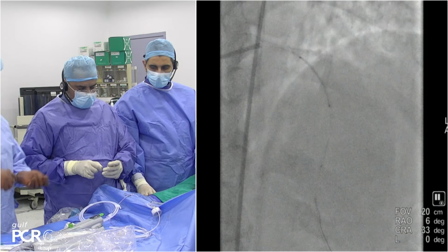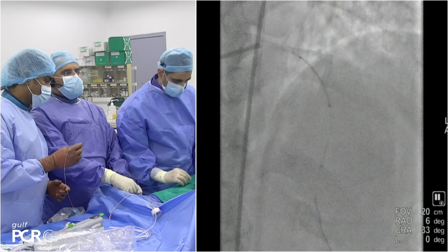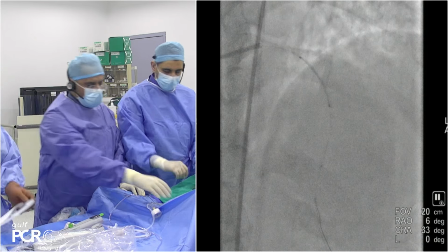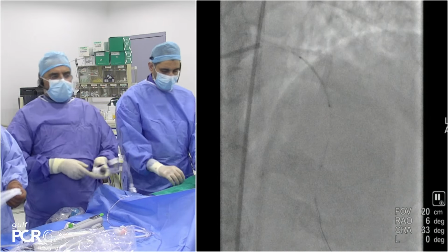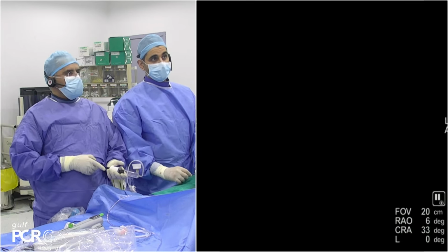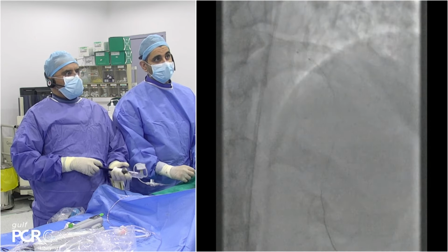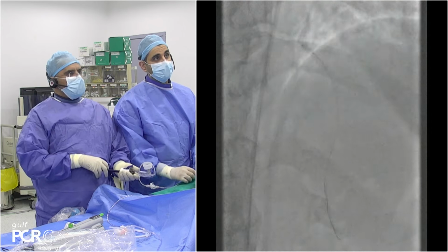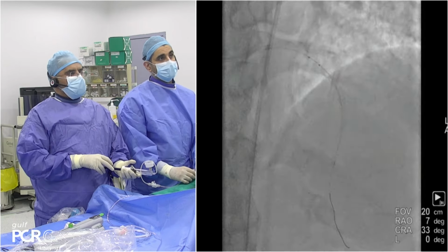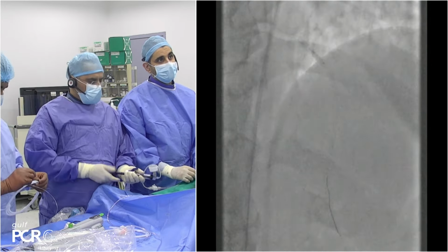Thank you, Ahmed. Ibrahim, these are well-taken points. But we felt the balloon was opening and we felt more comfortable going with the stent. If we had a waist, we would have gone with shockwave definitely, and we have it on the table ready. But we were reassured by the balloon inflation. If I might add, you can cause dissections by the rota and orbital as well, even without the ballooning. That's number one. Number two, with the orbital or rota, you have the tactile feeling and the auditory effect that you've done enough. So that usually can be sufficient. From what we felt with the orbital, we had done enough, so we went with the ballooning.